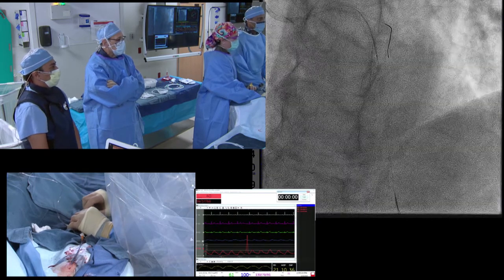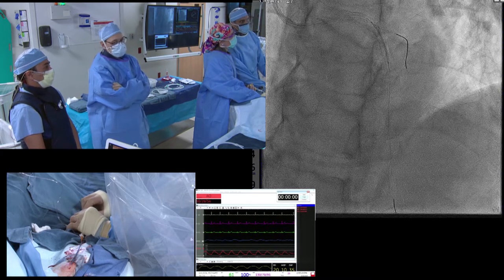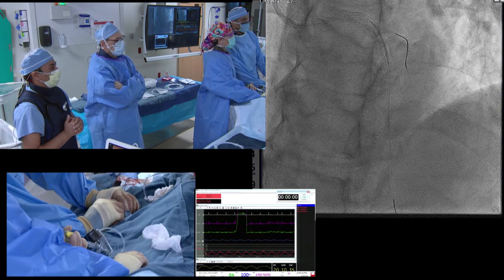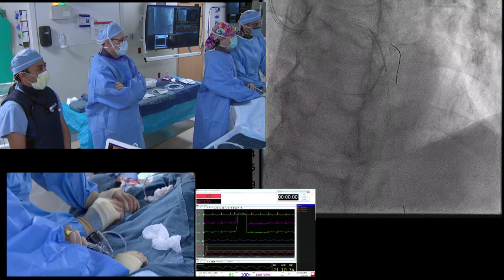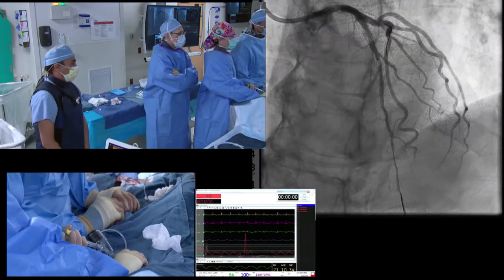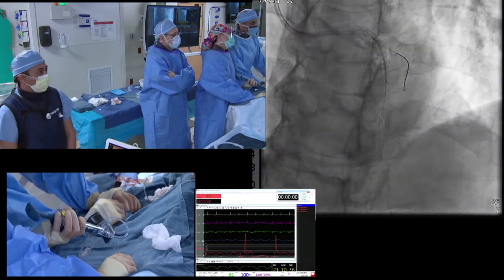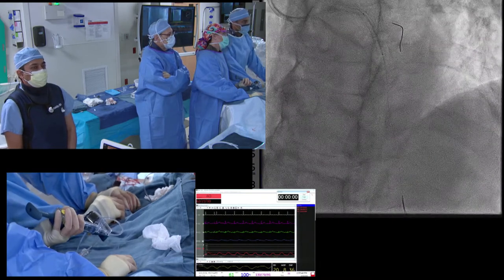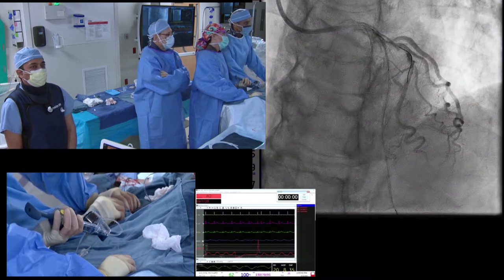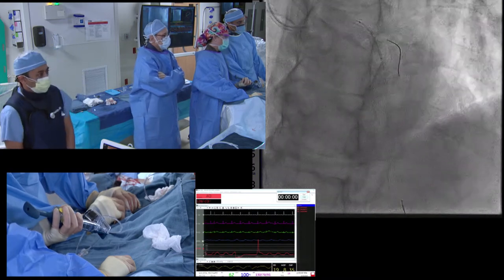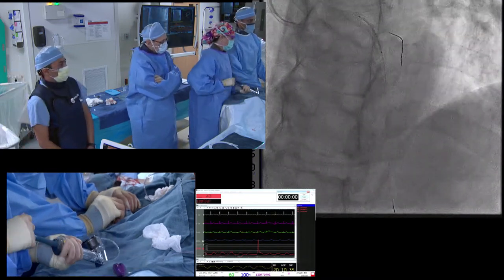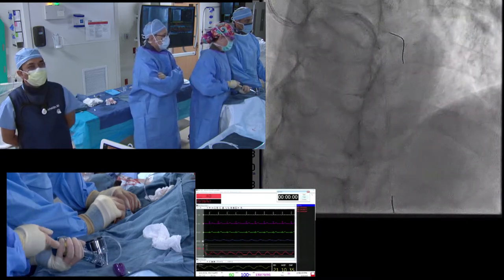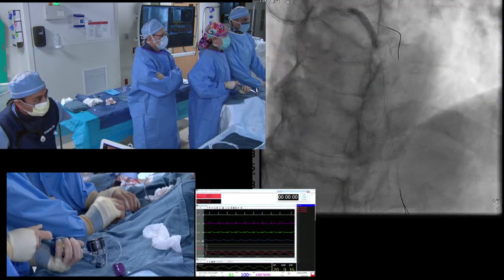I think you're in a good position there. The nice thing with OCT co-registration is you know exactly where the lesion is, where your proximal and distal are on the OCT software, and you can match that with your live image. Going ahead with stent deployment — nominal pressure on this is 11 with a rated burst of 16. We'll go up to nominal at 11 atmospheres. That looks big — good.